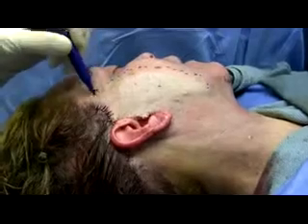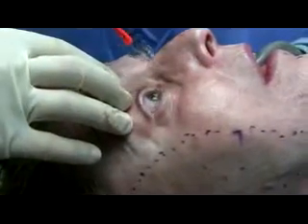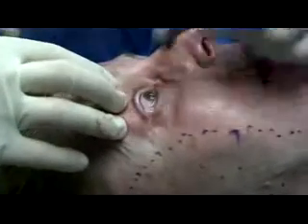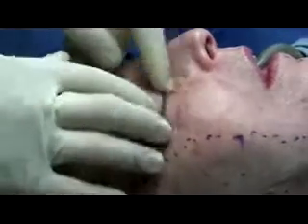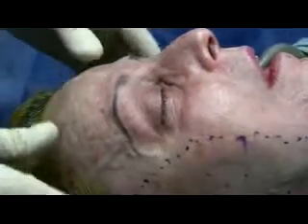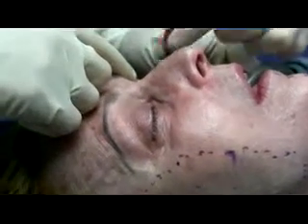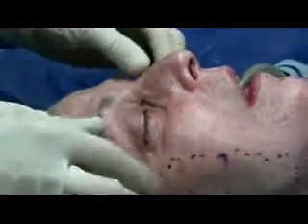going to turn the density down but use the same fluence. We're going to put some laser corneal shields in. This is 2% xylocaine, 1 to 100,000 epinephrine. You really don't have to use a dedicated ophthalmic anesthetic. And put these in bilaterally. We've actually already put that in earlier. We're just putting it in again for demonstration purposes.